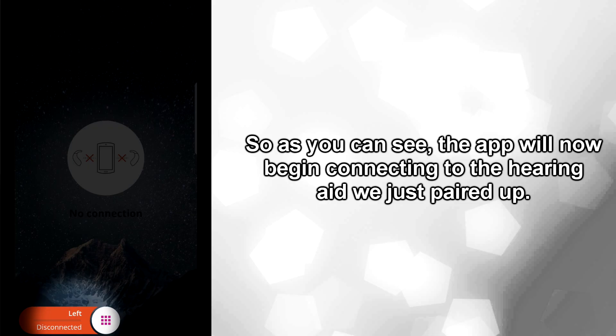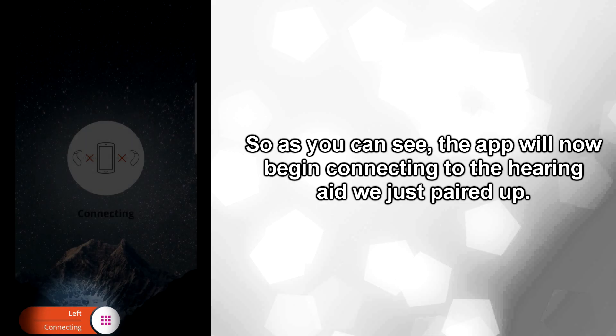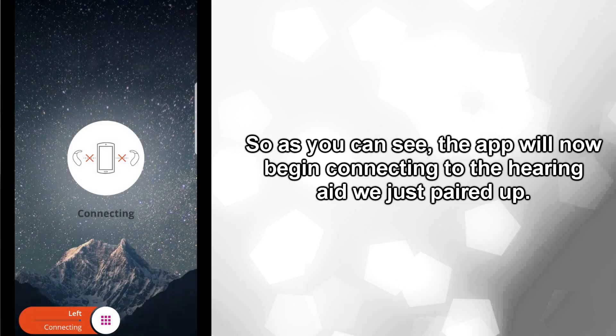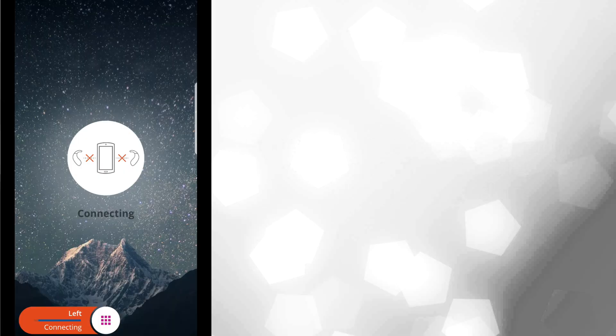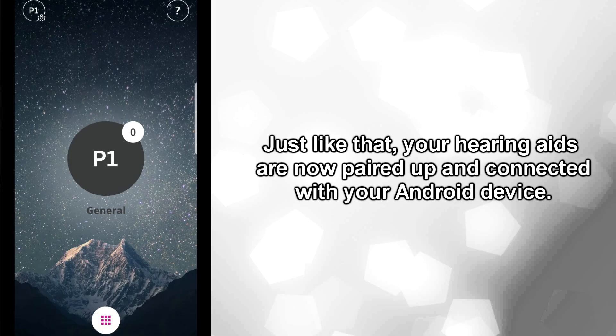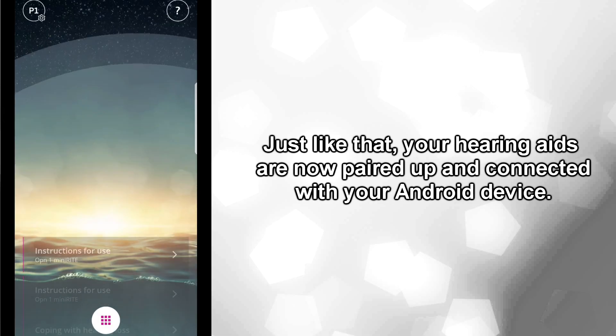So as you can see, the app will now begin connecting to the hearing aid we just paired up. Just like that, your hearing aids are now paired and connected with your Android device.